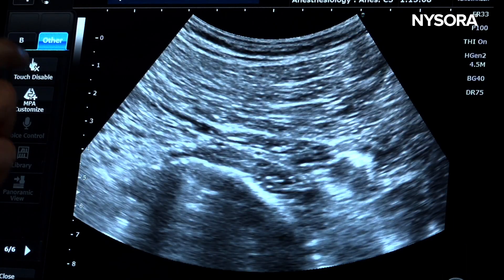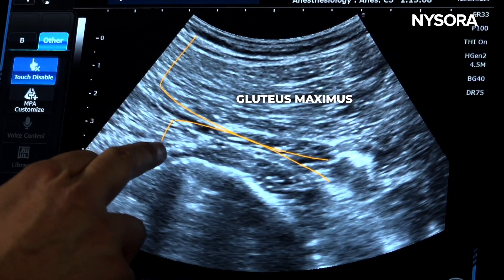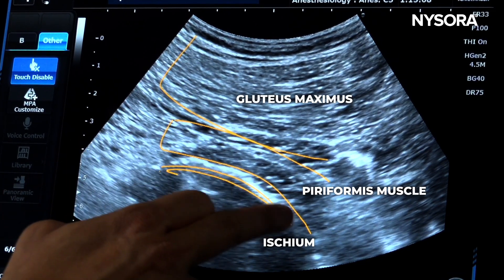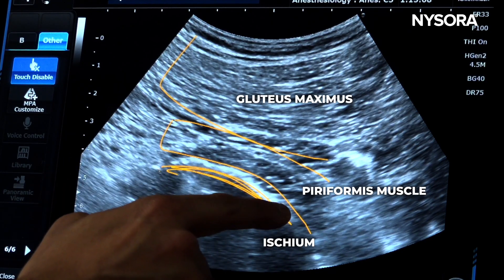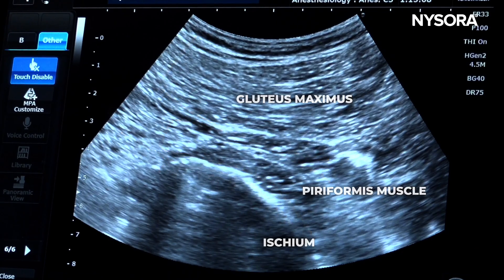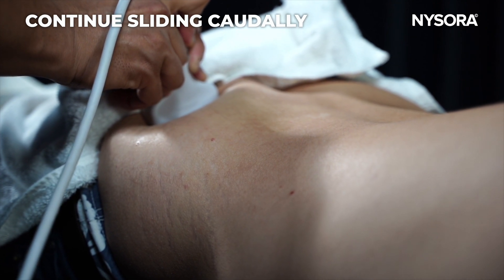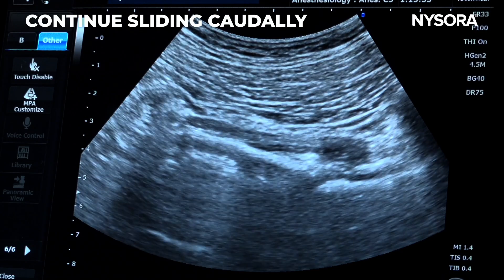Here we have muscle on top — gluteus maximus — and below gluteus maximus is piriformis, with the curved ischium visible. We keep scanning caudad, paying attention to this curved bone. This curve will eventually become a straight line, which will be the ischial spine. Put a lot of pressure and toe in, and you will see the ischium become a straight line.